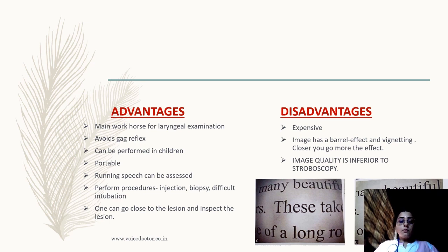So what are the disadvantages? The disadvantage is that it is more expensive as compared to an indirect laryngoscopy. Now, the image quality that you get has certain features. One thing is a barrel effect.